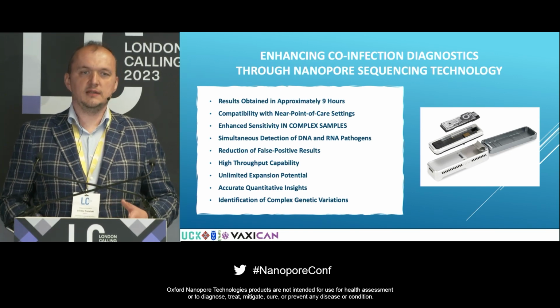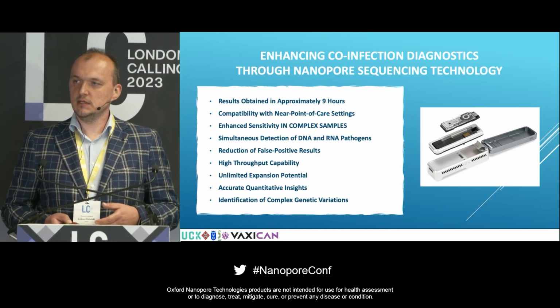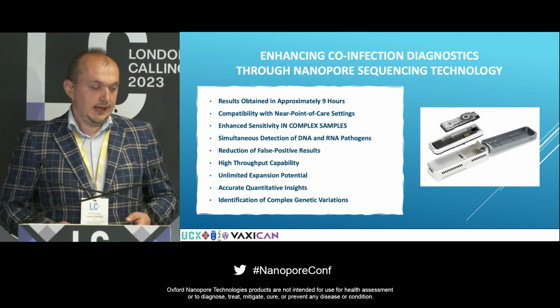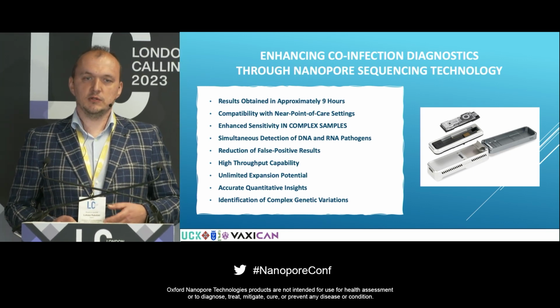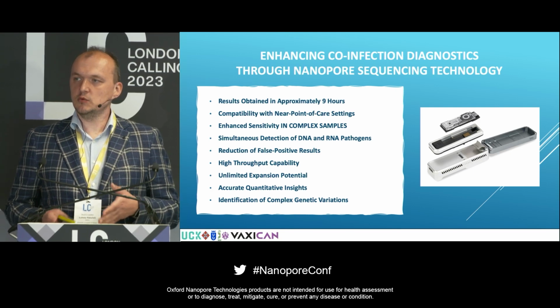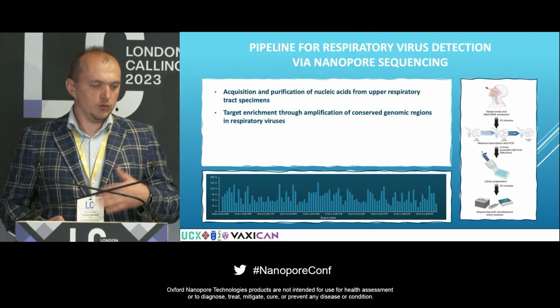And because you analyze the raw data, your results are almost free from false positives based on, for example, a positive control, because the sequence of the positive control will be quite different from the sequence of your sample. Of course, cross-contamination exists, that's normal, but because you can multiplex a practically unlimited number of targets, you don't need to put multiple reactions per single sample.